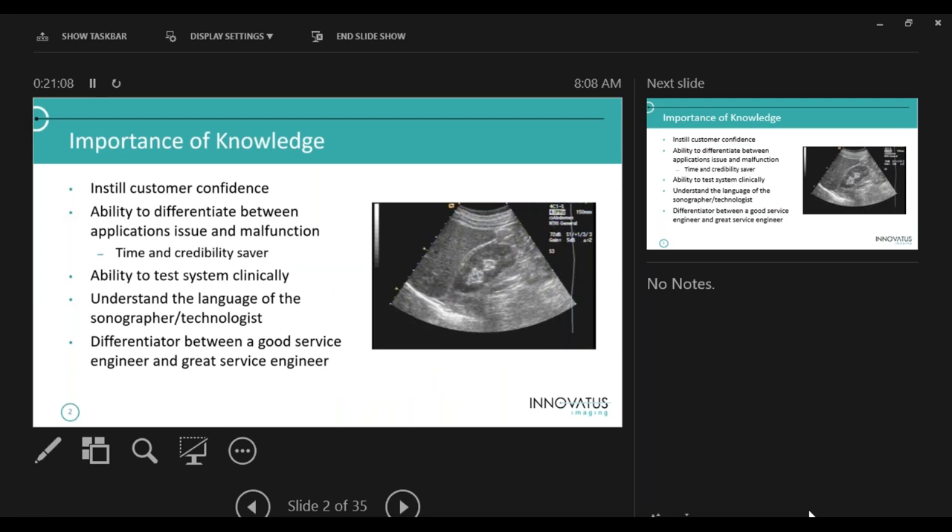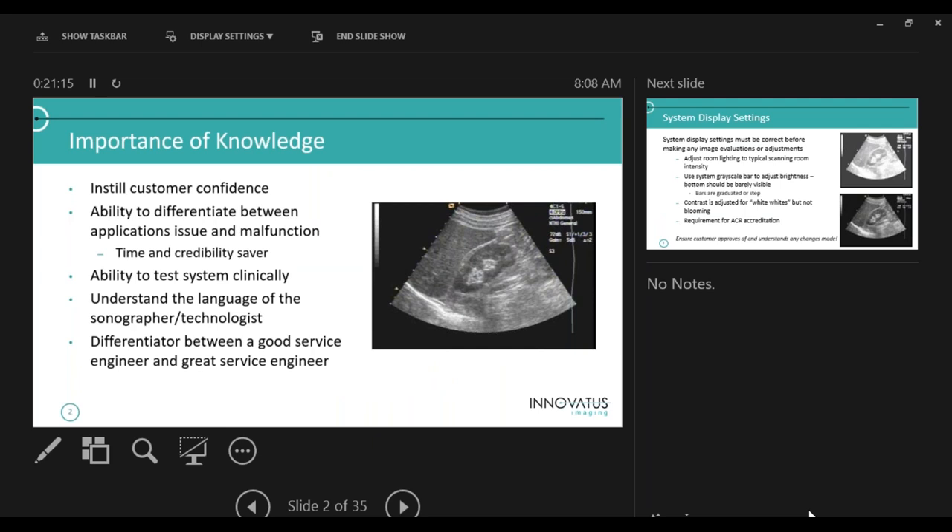So why do we even know this stuff? It's to instill customer confidence. If you go in and the sonographer starts telling you about a problem and you lift up your shirt and start scanning, you say 'okay, I know what you're talking about' — they're going to look at you like you're here to fix my problem. The ability to differentiate between applications issues and malfunctions is key. Throughout my quarter century of service, I'd go in for a service call and they'd report 'my machine's broken' — and I'd go in and find it wasn't broken, just something not adjusted correctly, like the monitor.